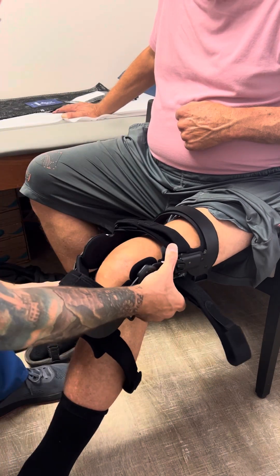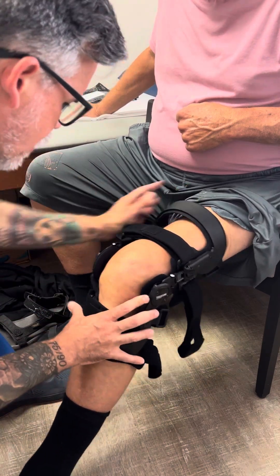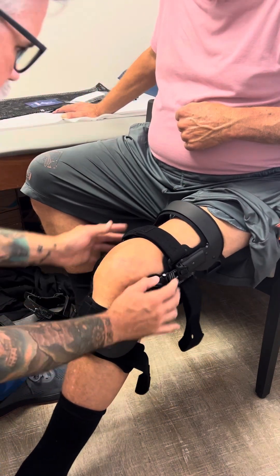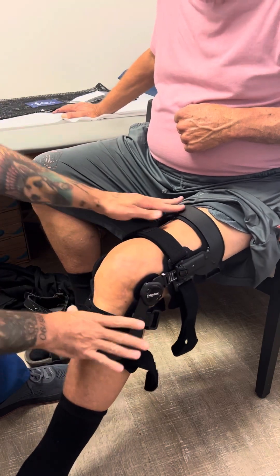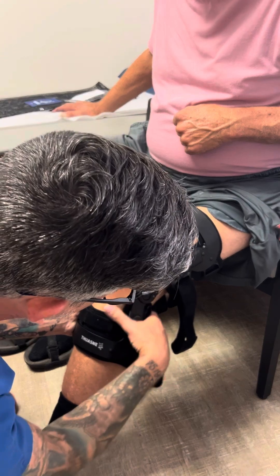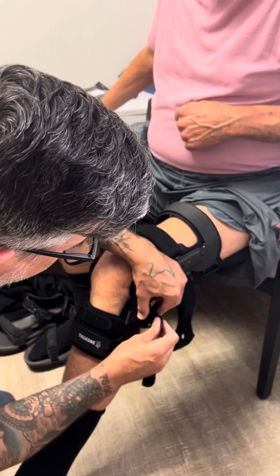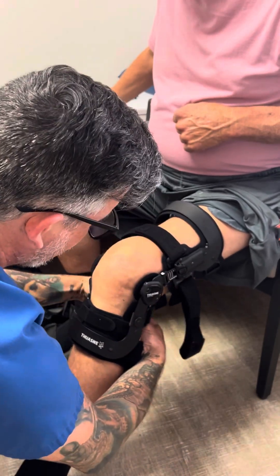I like to do the top first and open up the flaps, then slide it down the patient's leg, getting the hinges all the way back so the straps are snug against the leg in the front. Always do the strap right above the calf first — right under the knee. The reason we do that is because that one really holds onto the ball of the calf. Tighten it down nice and good.